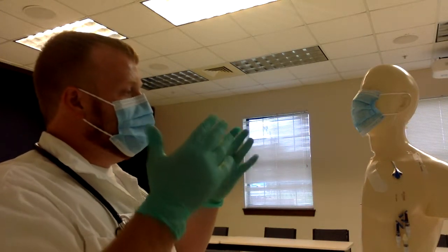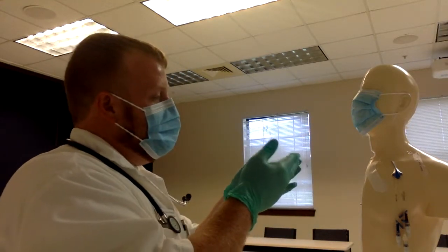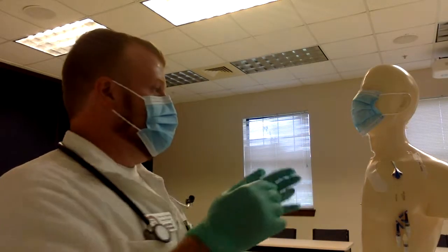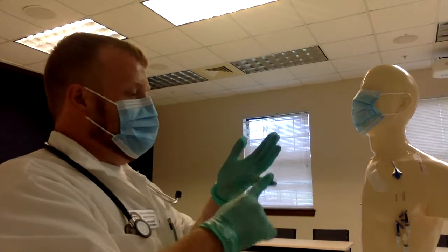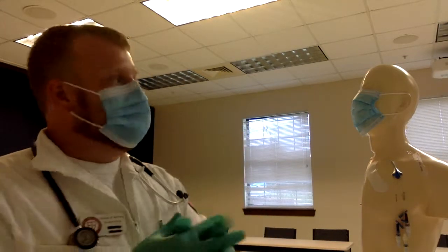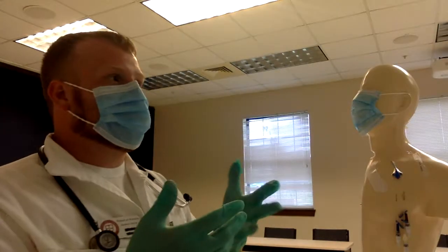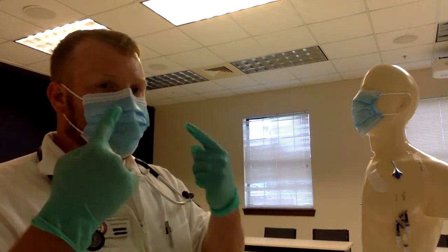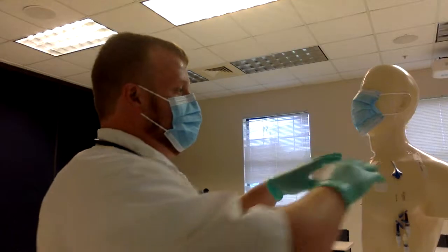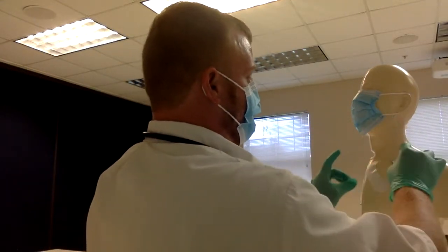Also, anytime you're working with this, make sure you look for any drainage when you're cleaning it or just inspecting it. You want to make sure there's no drainage, redness, swelling, or tenderness to the area. Again, your patient is the best one. They're going to tell you these things, like, oh, it hurts to touch. You can visually see the redness or swelling. Anyhow, that's my little soapbox, but we have the new dressing on there now.